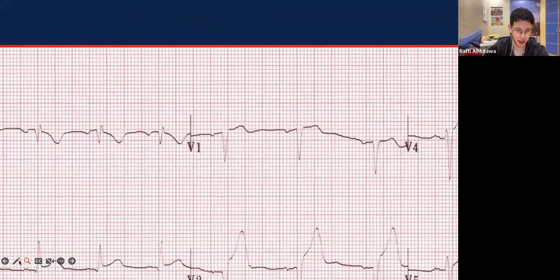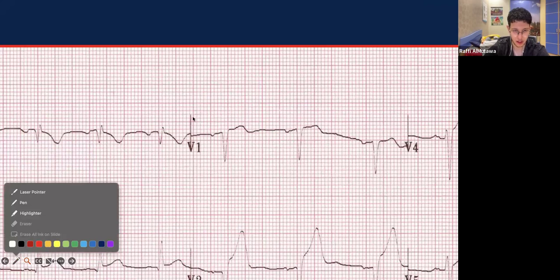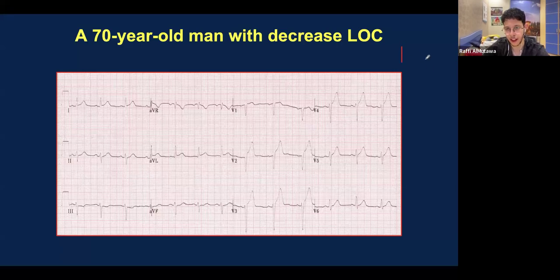Just to show you guys, it's not gonna let me draw it. But we have the big box which has 5 small boxes, and let's say this is a 1 by 1 box.